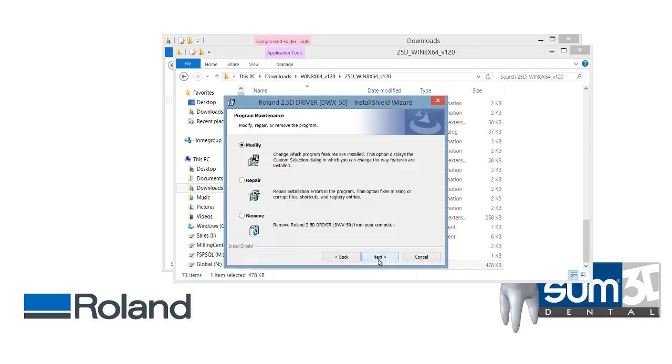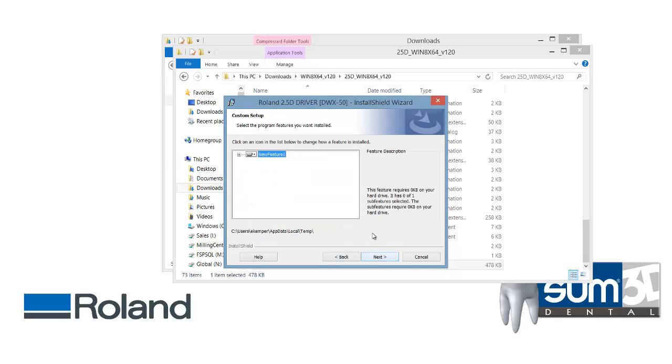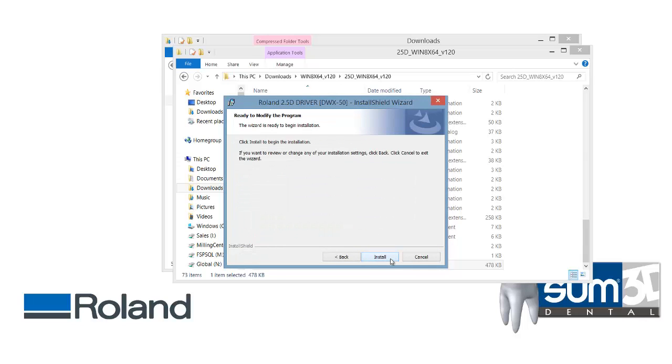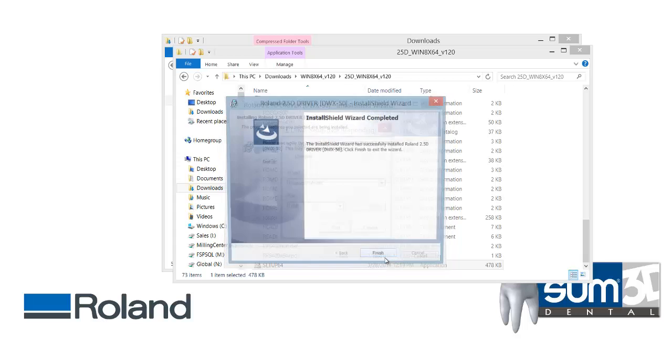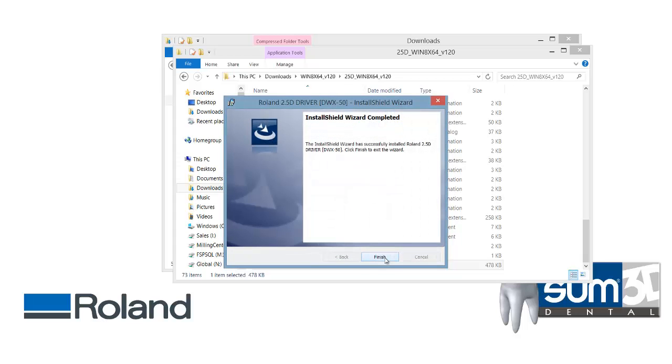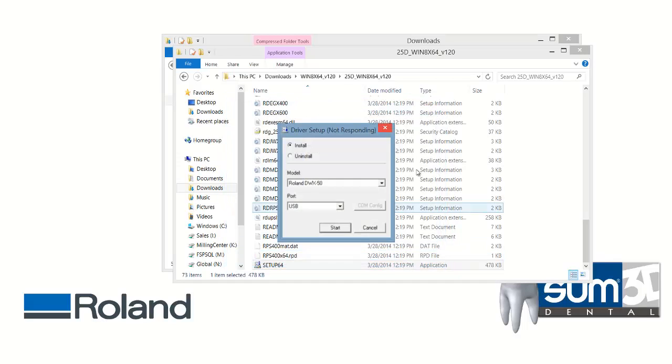The wizard will walk you through the installation. When it's finished, click finish.